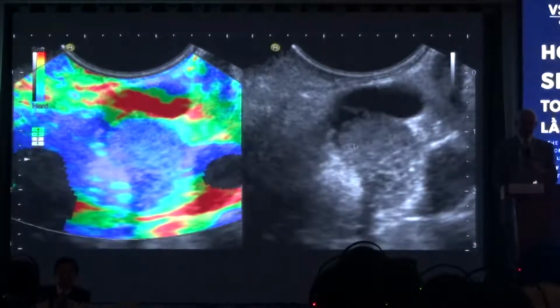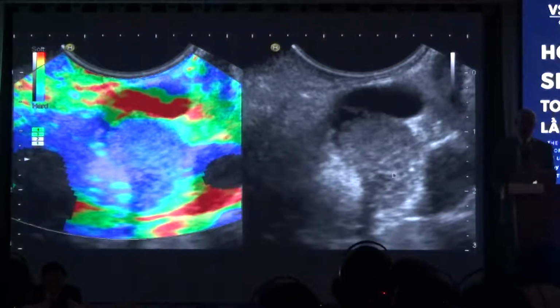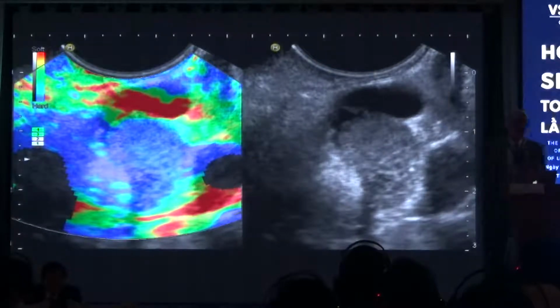Or here you can see a malignant infiltration in a normal sized bile duct beyond the bile duct. And you can see elastography shows the proof of principle, proof of feasibility, that there is malignant infiltration beyond the wall. So it's not only good for detection, it's also good for the infiltration beyond the wall, as I've shown for the intestinal wall.